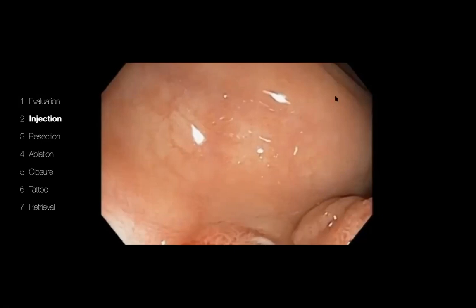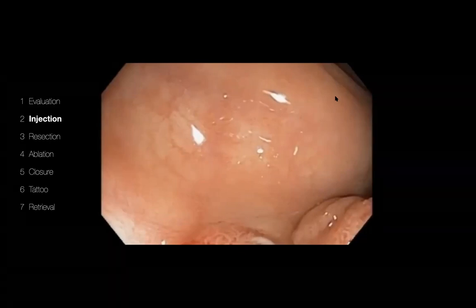The reason why I do this is also because once I had an endoscopic resection in the cecum, and he developed signs of perforation, and when they did the surgery, it was noted that there was a lot of ischemic changes around the bowel wall. So those things have made me think, especially in elderly patients, when I do EMR, nowadays I don't tend to mix adrenaline. I just simply use either saline or Gelofusine mixed with indigo carmine.